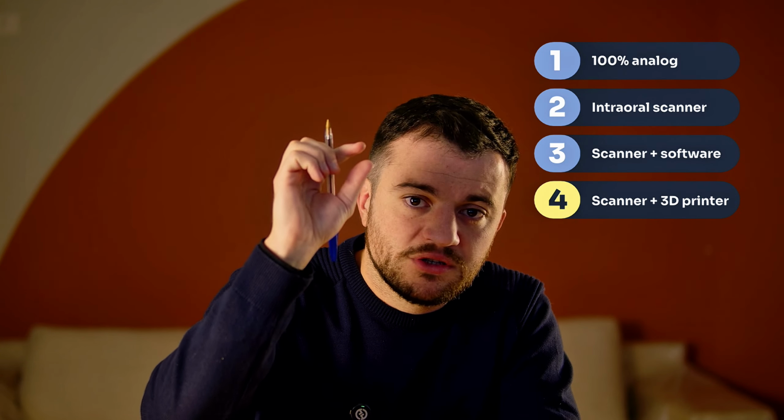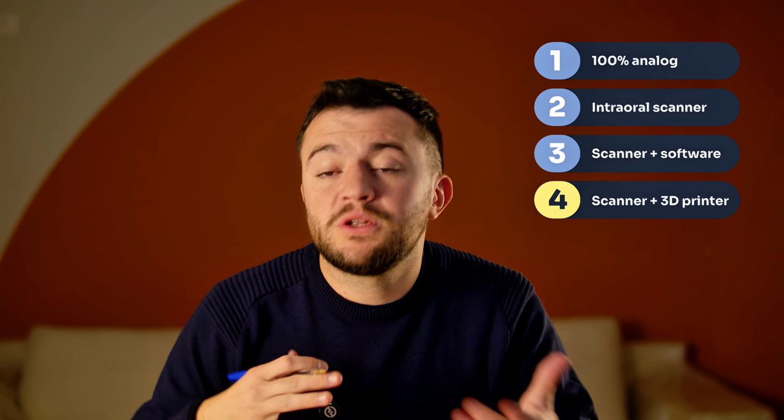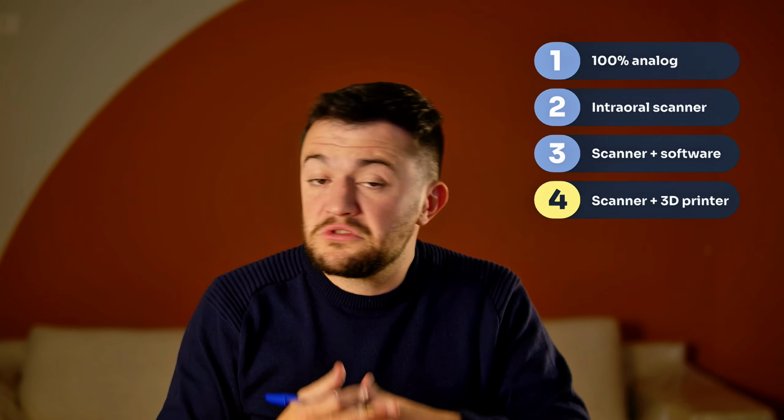What a doctor can do once they have a 3D printer in-house, we're not only talking about crowns and bridges, we're talking about bite splints, surgical guides. There are a bunch of other things that can be done once you have a 3D printer in-house, but that's usually what we call here number 4. So they've already scanned, they learned how to design, and now they're starting to do something in-house, maybe a long-term temporary with those ceramic loaded crowns, start to do bite splints, start to do surgical guides if it's an implantologist.